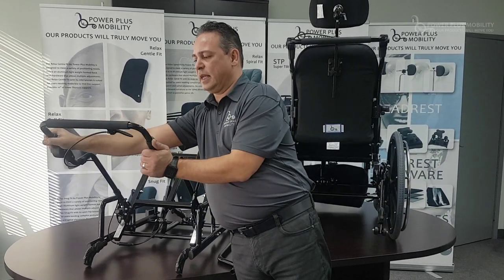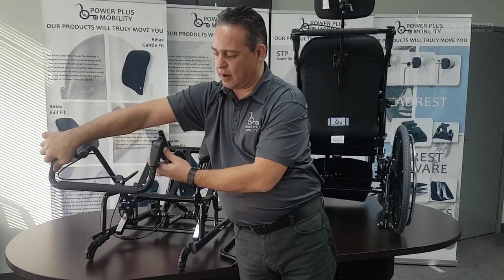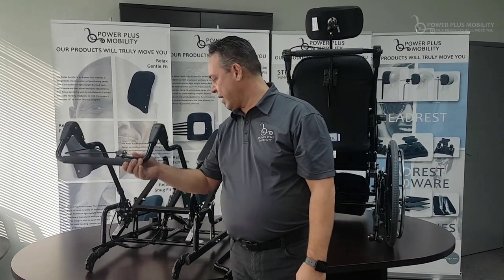our caregivers can easily access the stroller bars without having to reach all the way down below and bend to bring them back into a tilt position. So that's a standard option on all of our back canes.